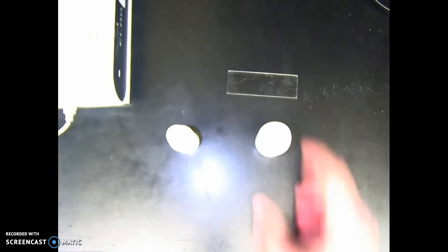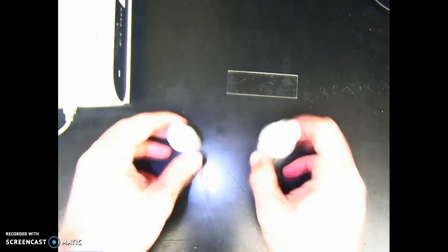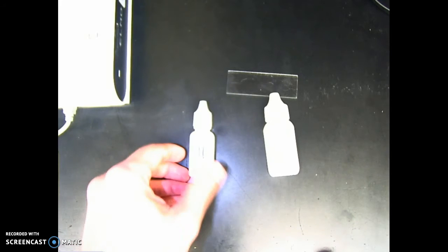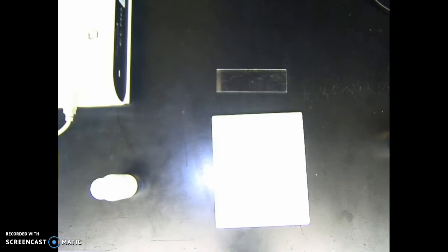So say that Frank had been assigned the large bottle 18, that's the number on here, and the small bottle 11. What you do is either grab a microscope slide, or you can grab what's called a well plate. They have little divots in here that you can add little drops to.